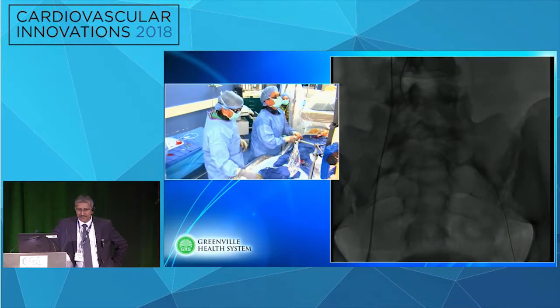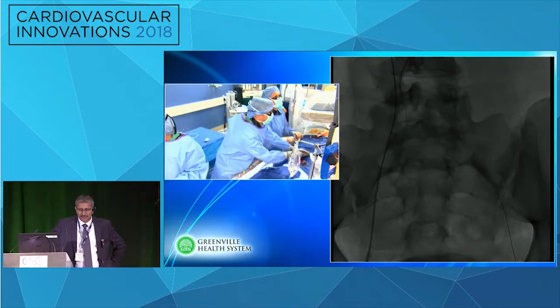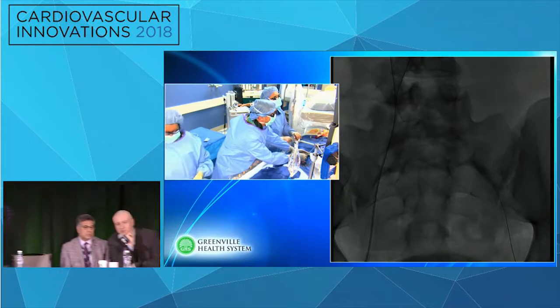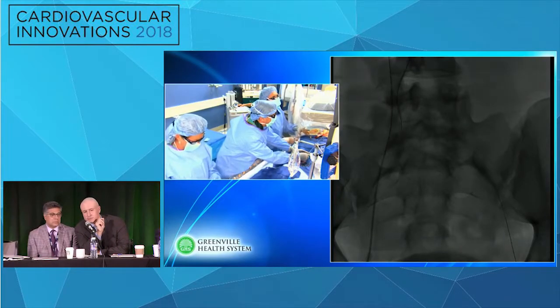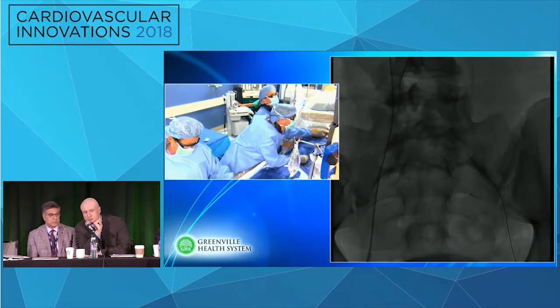Yeah, I think Mehdi's point is right. If you look at the angiogram, the tip was off of the wall. I actually think it's a little bit lower than that. This may actually be a good one for a steerable sheath like the Destino, where you'll be able to hold that angle and do a little gentle pecking with some targeting from your previous angiogram.